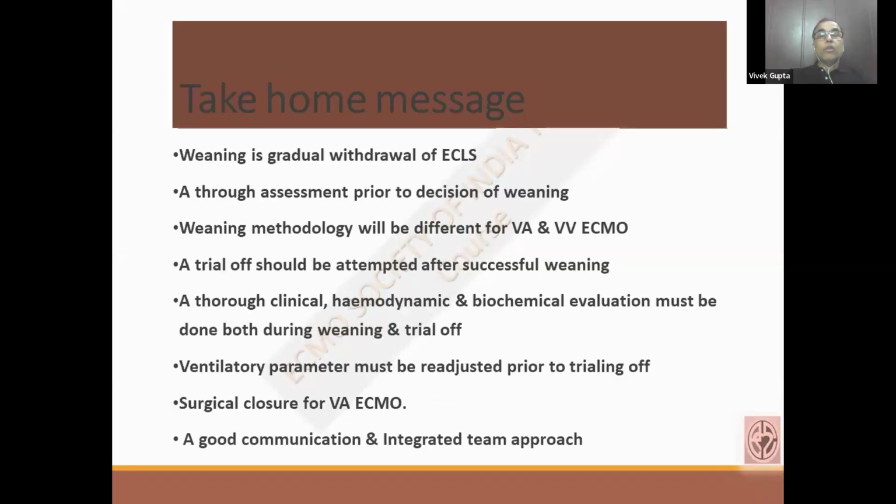So to conclude, weaning is a gradual process for withdrawing the ECMO support. A thorough assessment must be done prior to the decision of weaning. Weaning methodology is going to differ for VA-ECMO and VV-ECMO. In VA-ECMO, it will be a reduction of the flow, while in VV-ECMO, it's more the flow of the gases which can be reduced. A trial off should be attempted once you have achieved a successful weaning, and a thorough clinical, hemodynamic, and biochemical evaluation must be done both during weaning and trialing off.